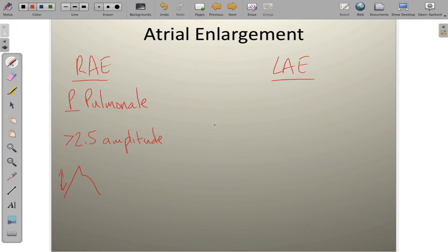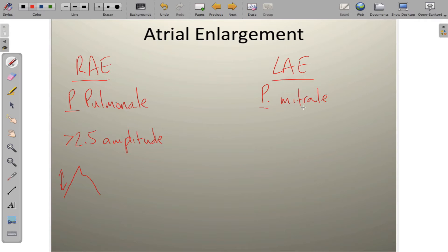Left atrial enlargement is also referred to as P-mitral, and this is often due to mitral valve stenosis. As that stenotic mitral valve causes the left atrium above it to work harder to overcome the pressures inside, the P-wave assumes a very specific shape. By the way, I should mention that the 2.5 millimeters of amplitude for right atrial enlargement is measured in lead 2.